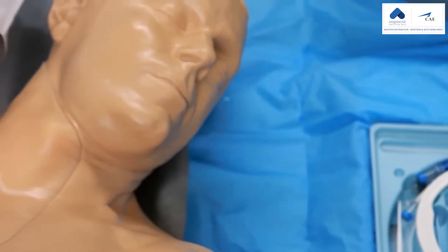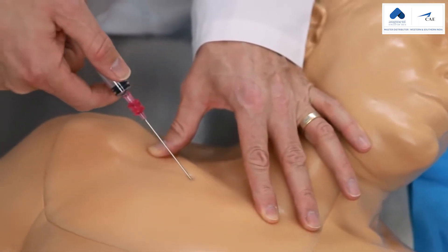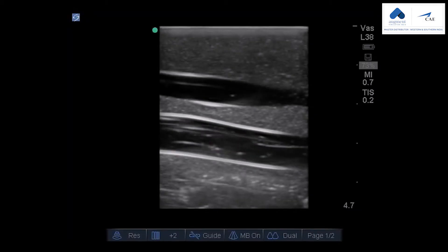Because of our new live cast modeling approach, the external landmarks are present in great detail. This optimizes your ultrasound guided or blind insertion technique training. When you put an ultrasound probe on the model, you'll experience excellent image quality.